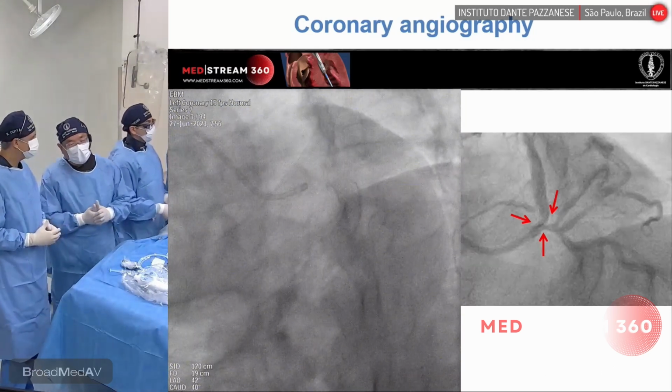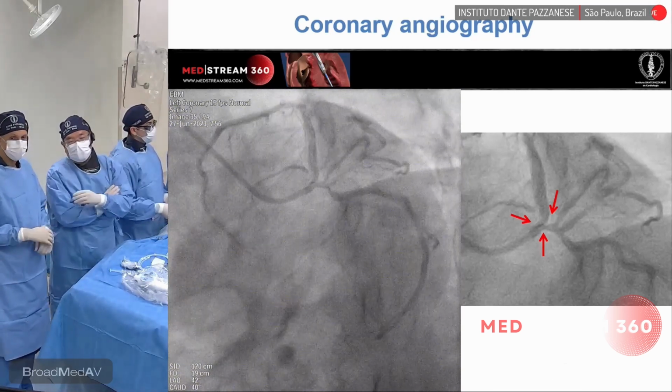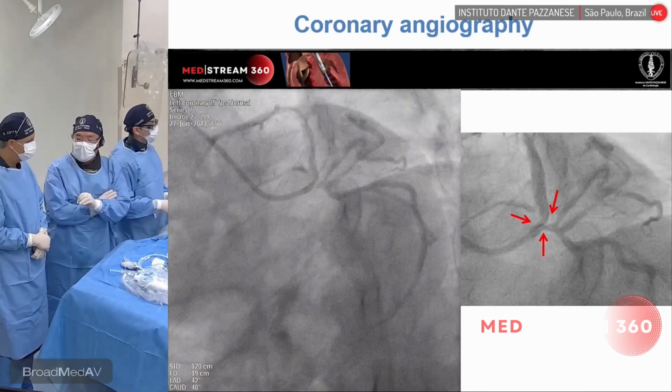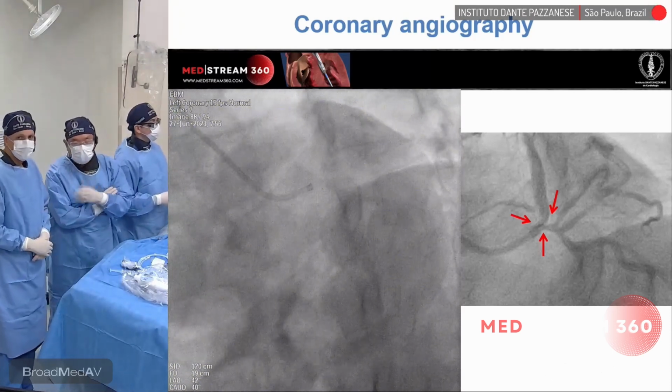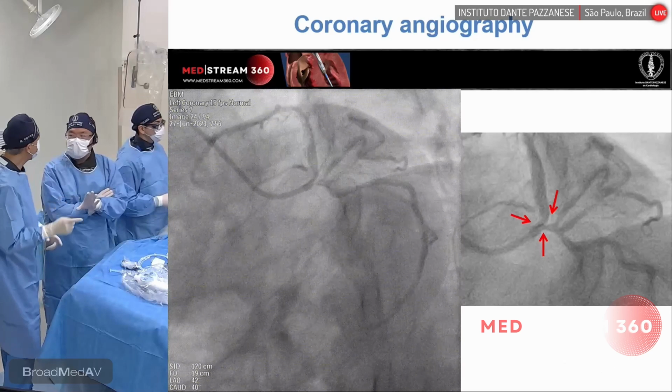Yeah, you can. Physiology, from this case, you have a severe lesion from the left main. So you're confident it's a severe lesion? Yes, I am confident from the angio that it is a severe lesion. Could you demonstrate that?